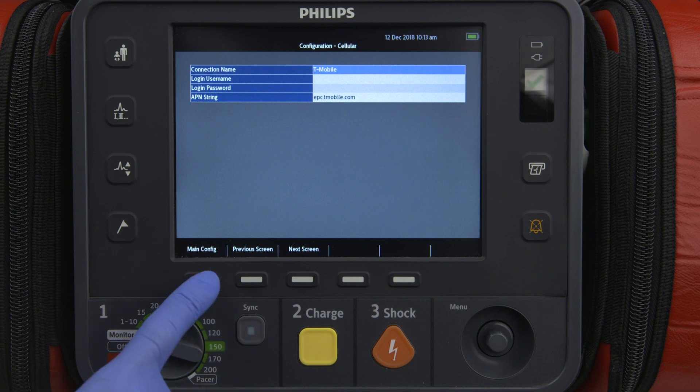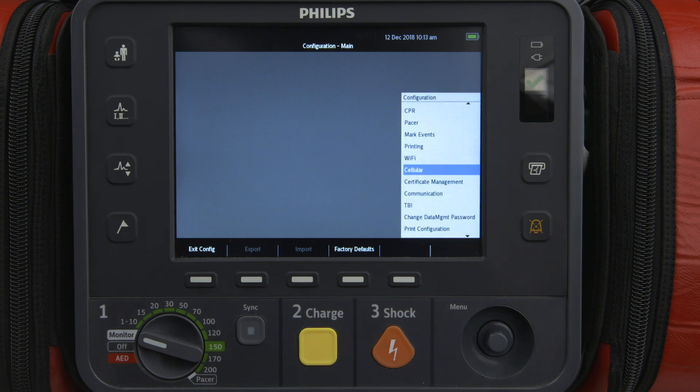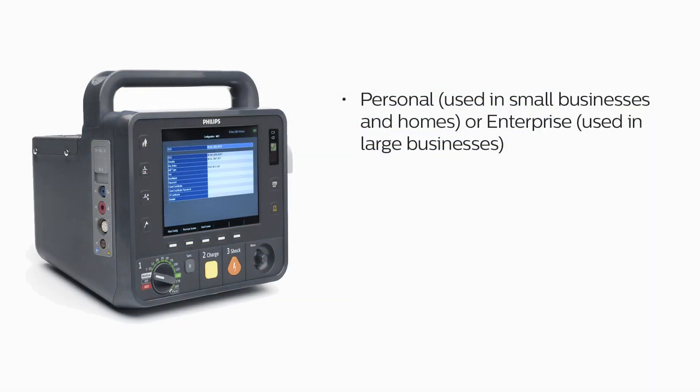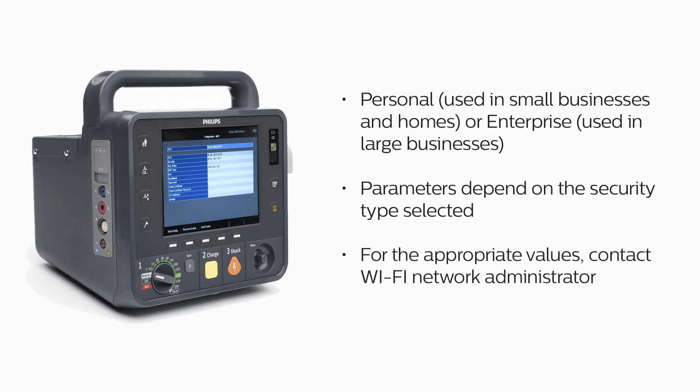If you will be using Wi-Fi to transmit data, you will need to configure the HeartStart Intrepid for your network. This is also done from the Configuration menu — select Wi-Fi to enter the Configuration Wi-Fi screen. Complete the fields with information described in the Instructions for Use Configuration chapter. Security can be one of two groups: Personal, used in small businesses and homes, or Enterprise, used in large businesses. Available parameters depend on the security type selected; not all settings may be required. For the appropriate values, contact your Wi-Fi network administrator.